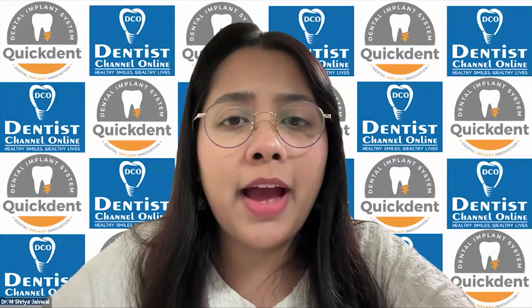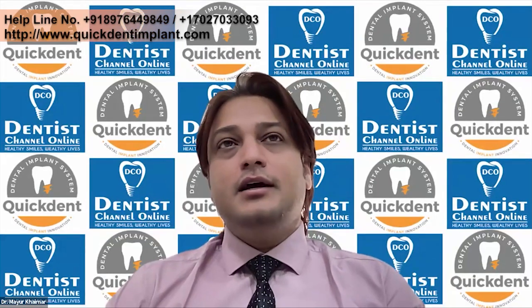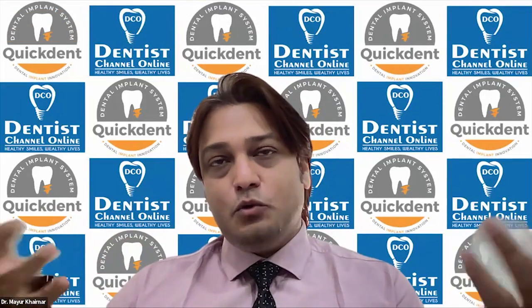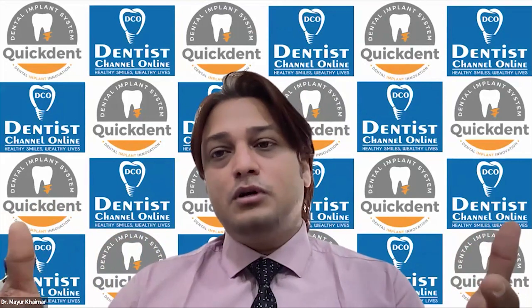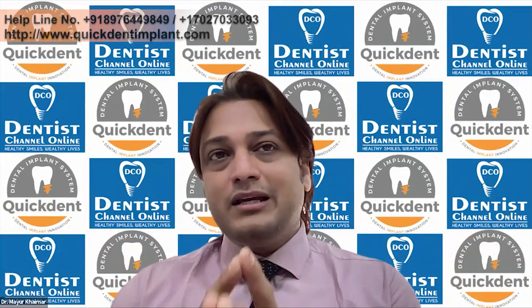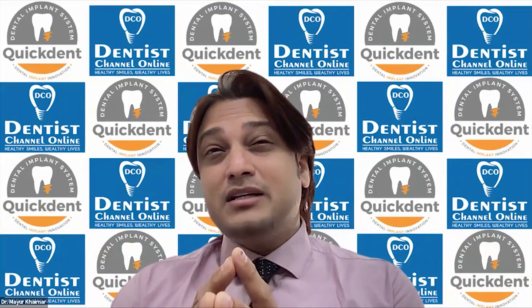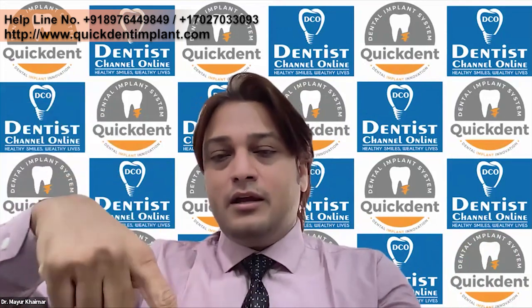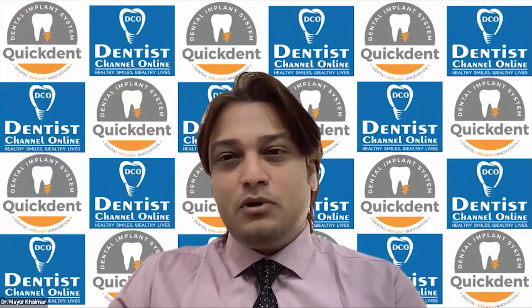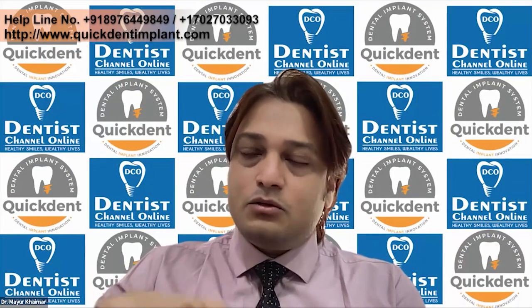In fully guided implant, do we have to worry about angulation? No, with fully guided implants, the guides are designed in a way that you can design your placement according to the requirements. You can place it at a tilt, you can place it straight also. One disadvantage of fully guided is that there is tremendous heat generation because you're drilling at high speed. So fully guided in dense bone creates massive failures compared to normal bone. The bone gets too heated.